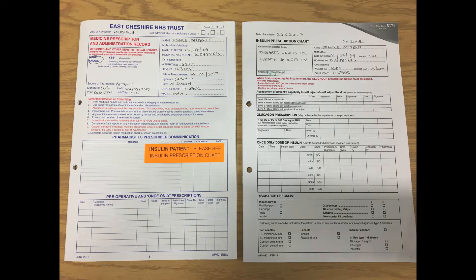The insulin infusion itself should always be prescribed on one of the designated sections of the insulin chart, but all patients will also need IV fluids to be administered alongside the insulin, and these should be prescribed on the medicines chart in the IV section at the back.